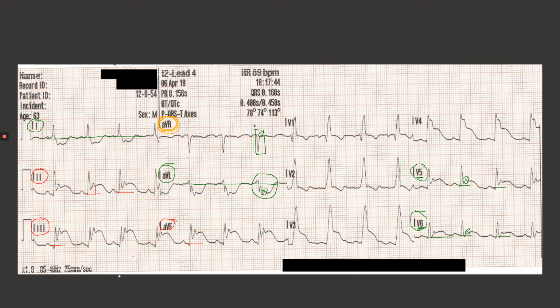And then looking through the septal/anterior leads here, I don't have it in V1, don't have it really in V2. V3, pretty easy to tell that I've got it, okay? You can see it very clearly, kind of right here, the sharp change in angle. That's what I'm using as my J point. Got it in V4. And again, that's contiguous because they're in the same group, right?